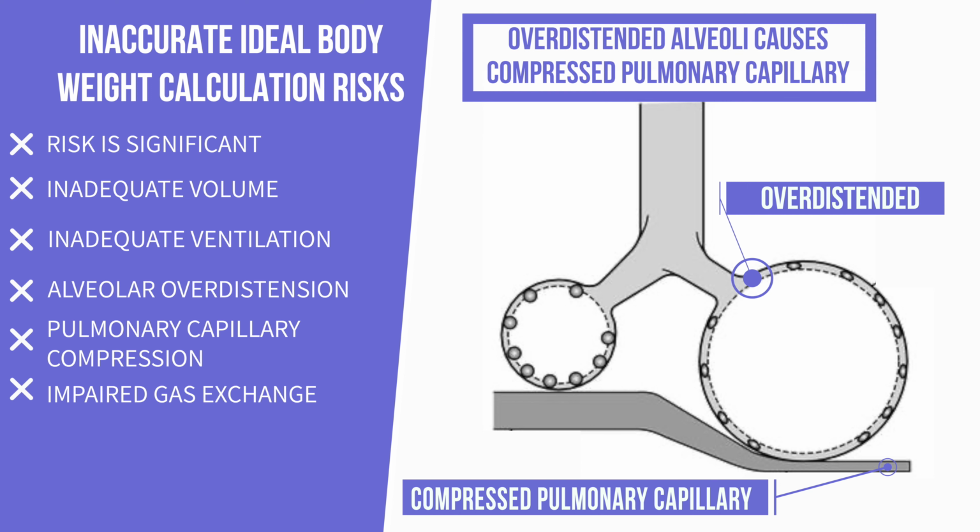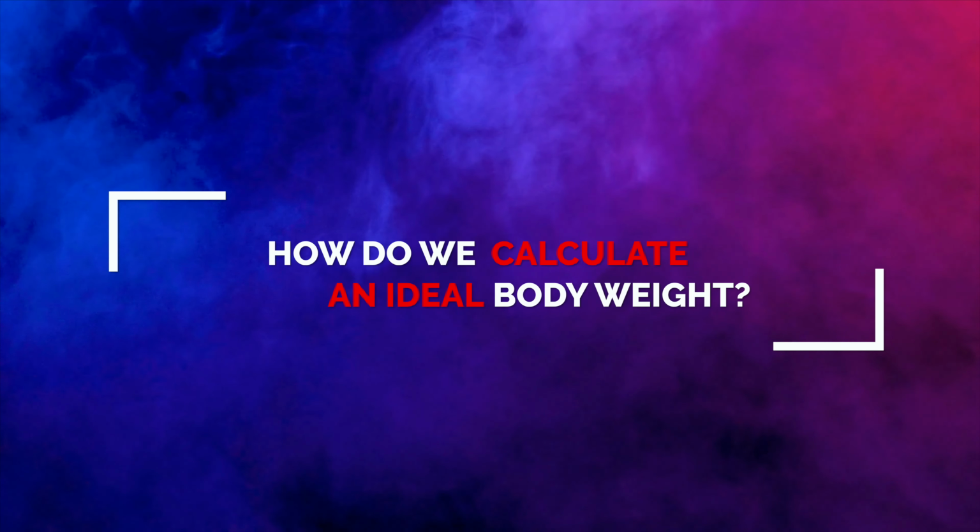role in patient care. Yes, the T1 is an exceptionally intelligent ventilator, but it only knows your patient's ideal body weight with your input. How do we do the ideal body weight calculation?